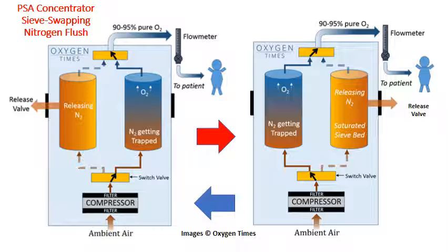Now, as I mentioned before, typically there is a third tank, an oxygen accumulator tank, so that instead of going directly to the flow meter, the output from the solenoid valve will go to a holding tank for oxygen. This acts similar to an electrical capacitor to buffer the oxygen and present a more uniform flow of oxygen to the patient rather than pulsed. Takes out the switching transients.